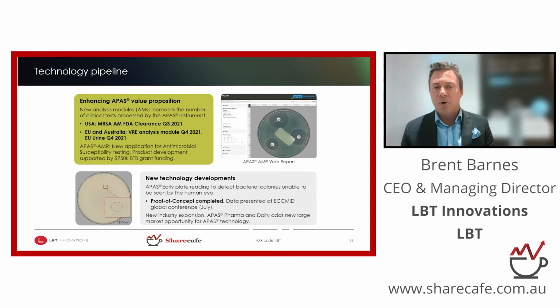And this is the picture on the top right hand of the screen. This is a disc diffusion method, and what this is looking to do is measure the zone of inhibition, which is looking at essentially the bacteria and how it is resistant to the antibiotic. And so those little circles or those little discs are the antibiotics, and the zone of inhibition around that is the resistance to that antibiotic. That's a really important part of the workflow, because it forms the basis of a drug recommendation to treat the specific infection for the patient. So kind of like that personalized medicine application there.